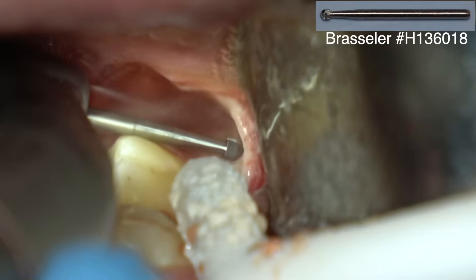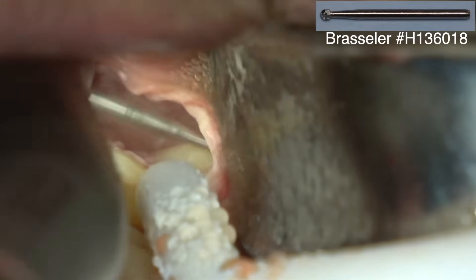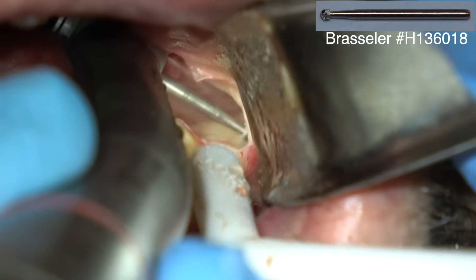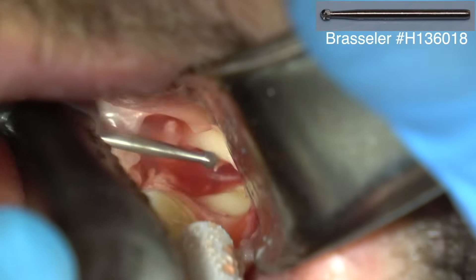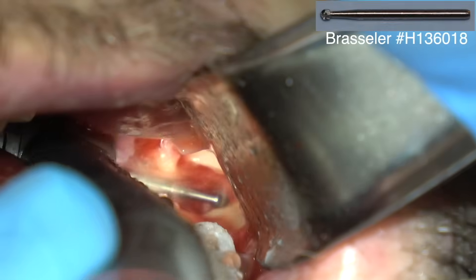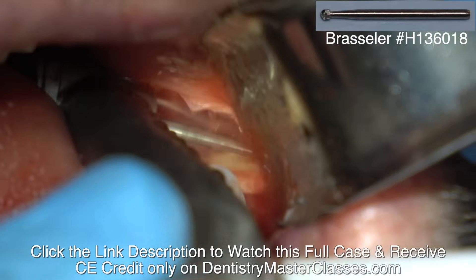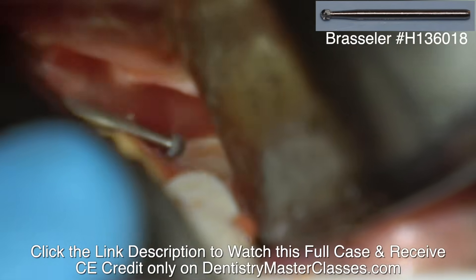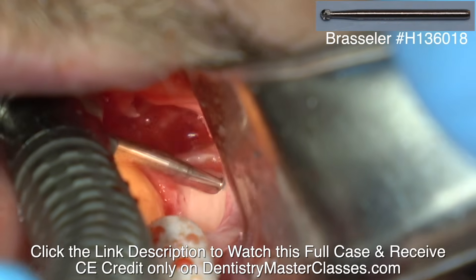Now I'm sectioning the tooth from the distal occlusal down to the furcation in this cut right here. Then I'm creating access on the facial — you can cut the bone or you can cut the tooth. I'm trying to remove tooth structure because we're going to lose the tooth anyway. And then I'm cutting behind the distal of the tooth to create a space to move the distal root and distal coronal part into — if you don't have a space, you can't elevate that piece of the tooth.